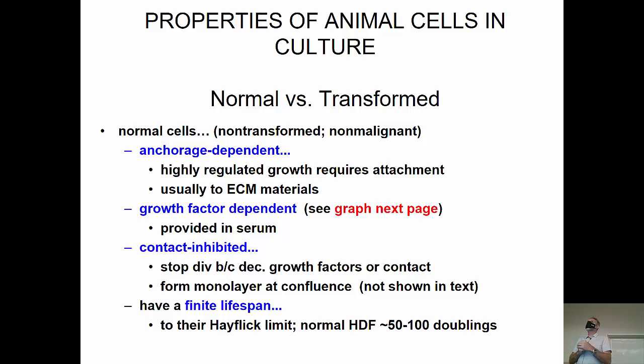And what we'll often do is provide serum. So what you do for serum is you take a sample of blood, and usually you use fetal blood for this because that's a phase of rapid growth, and also fetal blood is, of course, going to be sterile. And so you basically clot the blood, and the stuff that's left over, you give that to your cells.